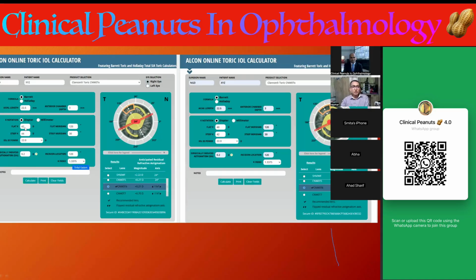I have kept everything else the same, including the incision, so the same calculation applies. This is how you will be able to calculate and decide. Changing the absolute value is not going to change the calculation about your incision, and if the SIA is the same, you will get the same axis of orientation.